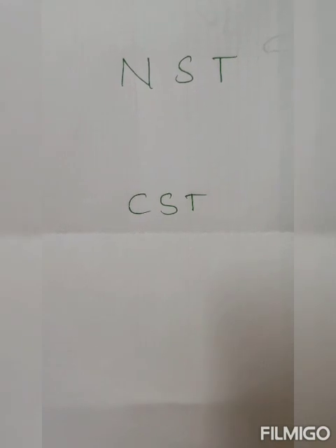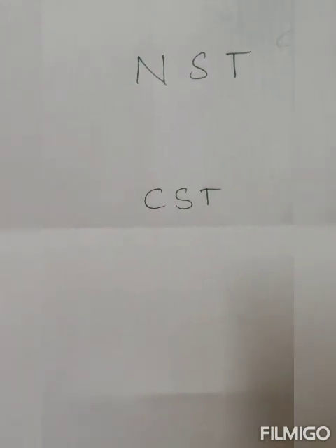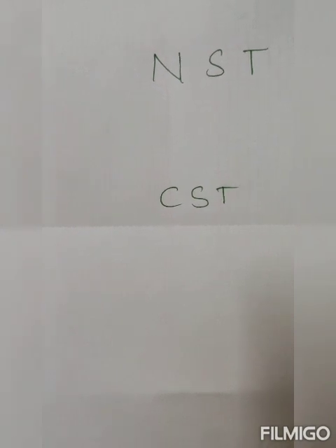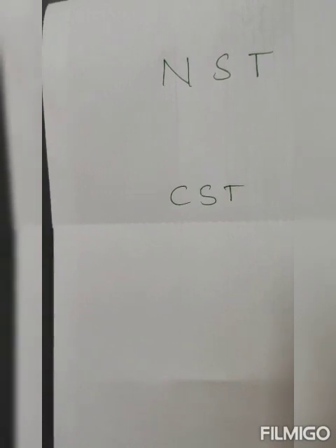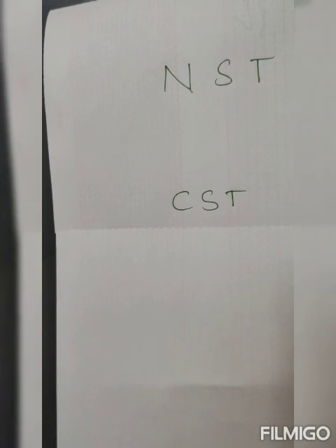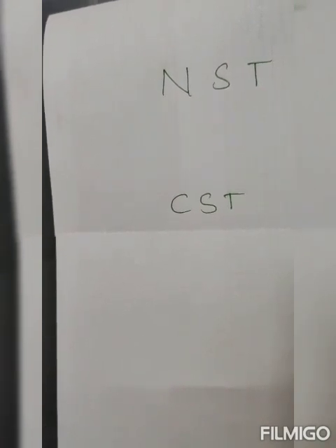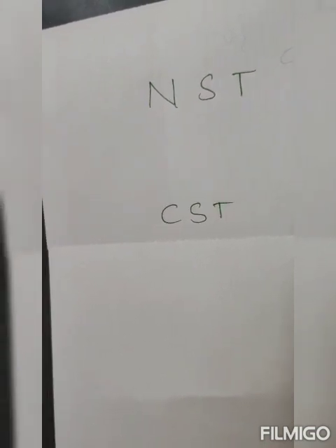Cardiotocography has high sensitivity, that means it is good at diagnosing the fetuses which are good. The possibility of the baby having hypoxia is very less when the CTG is reactive, whereas it will have low specificity, that means it is poor at identifying the fetuses which are unwell. It doesn't mean that the baby which is having non-reactive CTG will always be hypoxic.